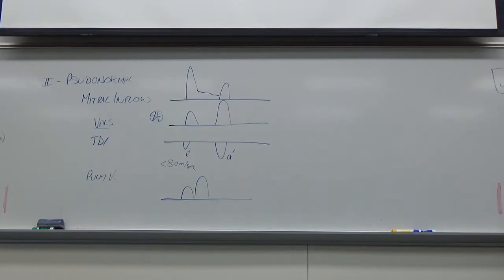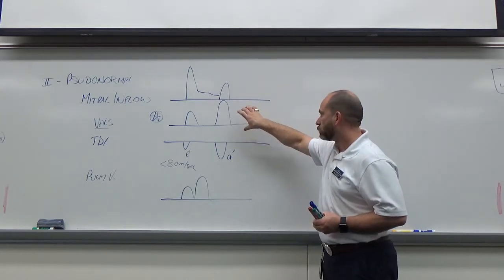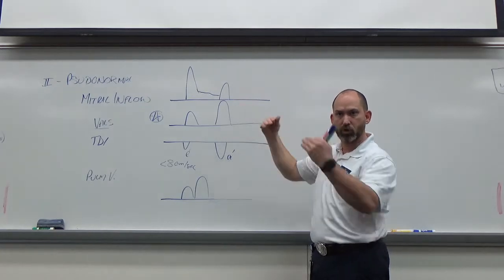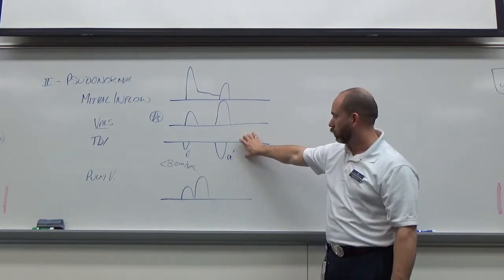And the duration of the A wave, let's see. Forget that. We'll just leave it at that. So again, visually speaking now, the major diagnosis is I've got a normal looking mitral inflow. Okay, it switches. It may or may not switch with Valsalva. I'm not super concerned about that, but a proven one where it does switch just says yes, it's definitely pseudonormal.